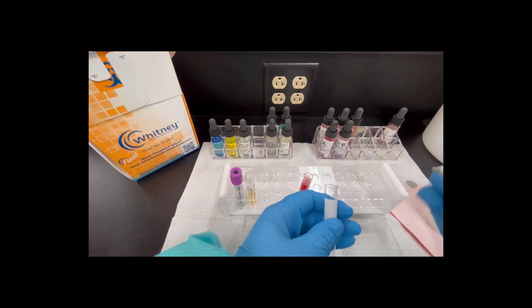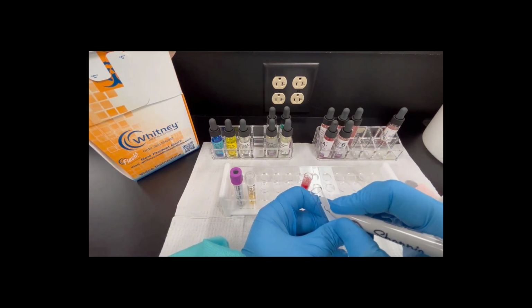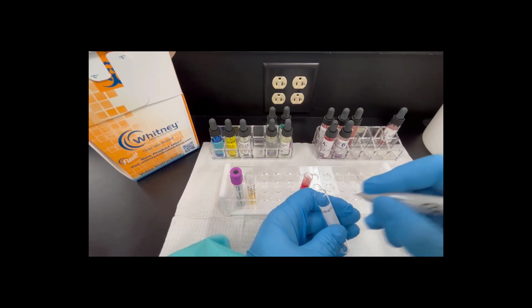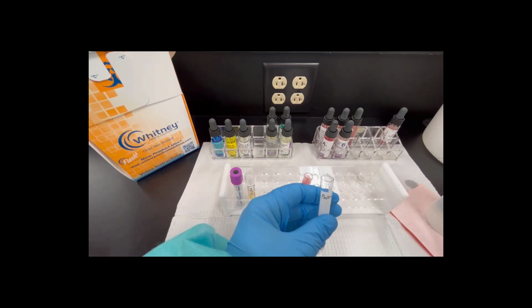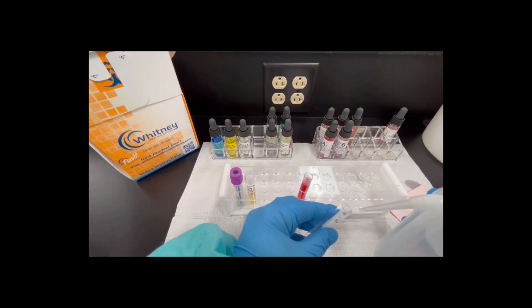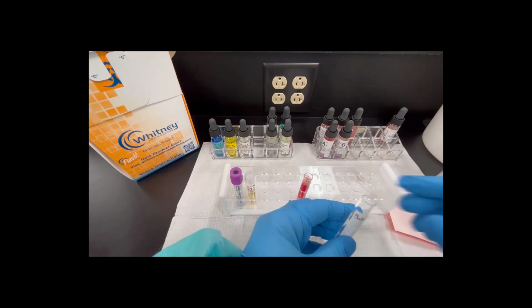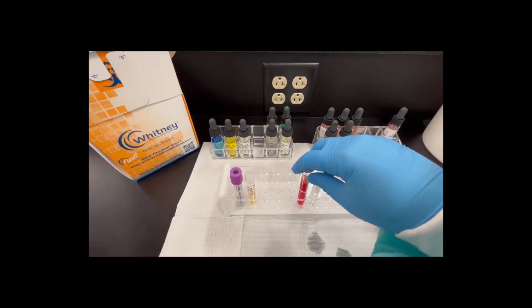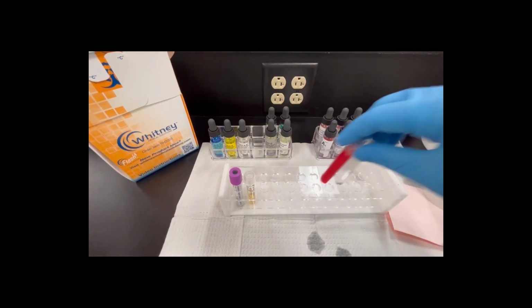Now on this tube, I'm going to write B-A-L-A-N-C-E. Remember, you should never have any tubes in your rack, even if it's just a balance tube, without it being labeled. So I'm going to fill this up to about the same amount with my saline. And you can see they're pretty close. And I'm going to move them over into my Serafuge.